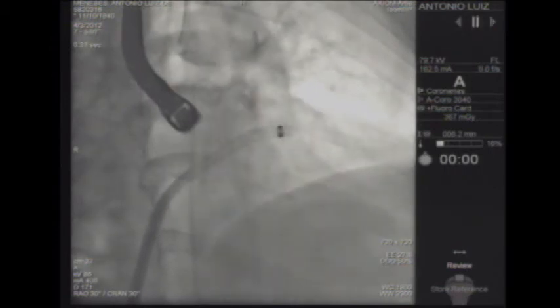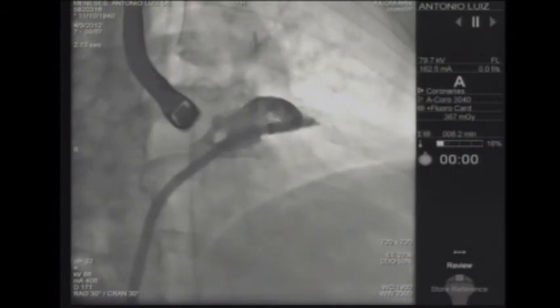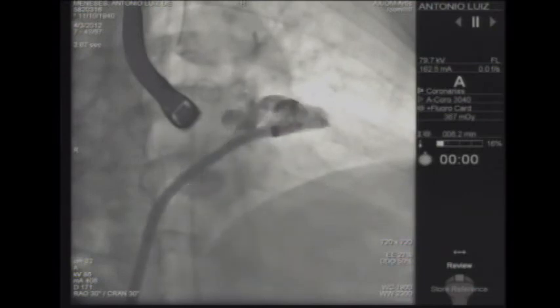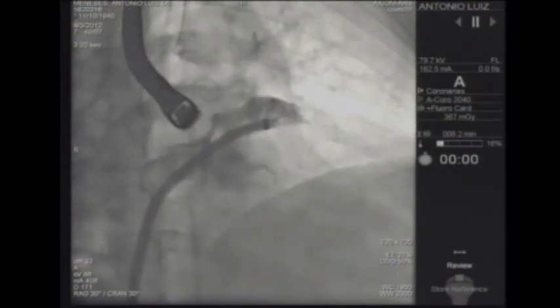Initially I thought, based on the echo pictures, that I had a good alignment between the tip of the sheath, the long axis of the sheath, and the axis of the left atrial appendage, but I don't. I have a good alignment with the body of the left atrial appendage, but not with the landing zone. So I'm going to have to rotate the sheath a little bit counterclockwise in order to deploy it correctly, okay?